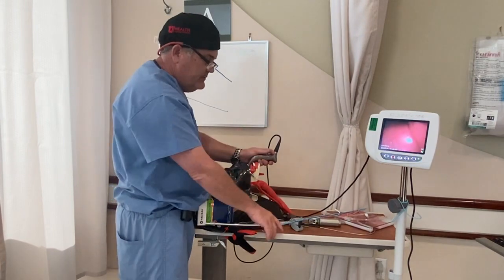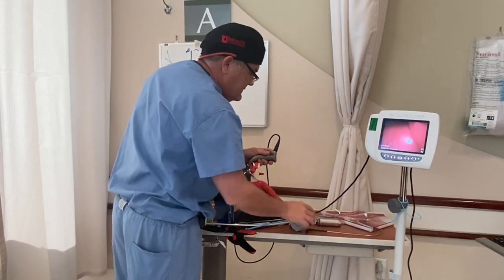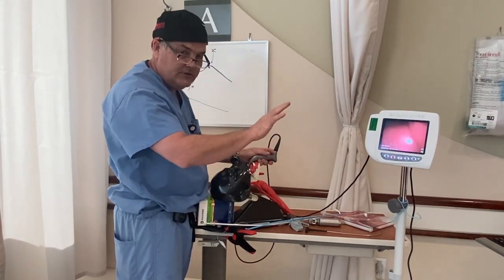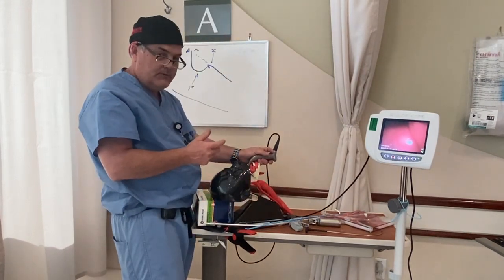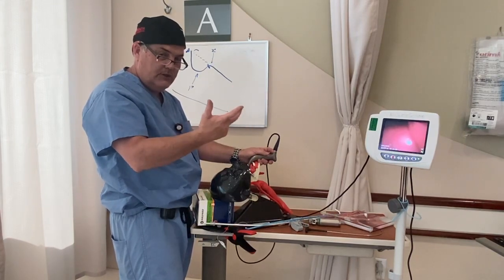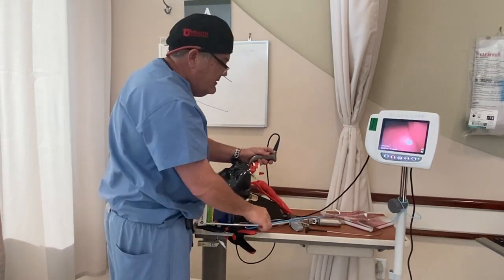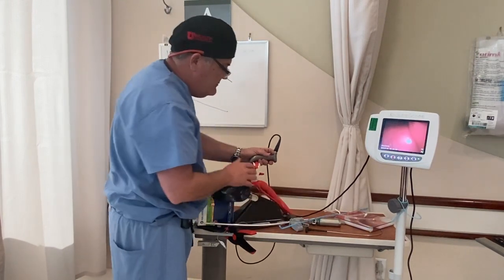That's the second part of the sequence: hyperangulated blade, linear bougie failure, then a pre-curved stylet success. They've now experienced failure at the primary curve and then success because we moved from linear technology to curved technology. They also experienced the force in their right hand as they went through the vocal cords, transitioned through the inflection point, and into the trachea posteriorly.